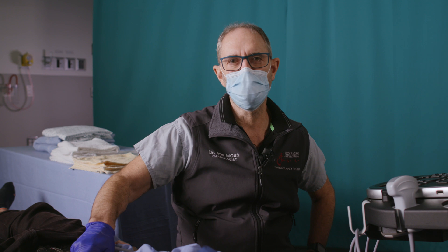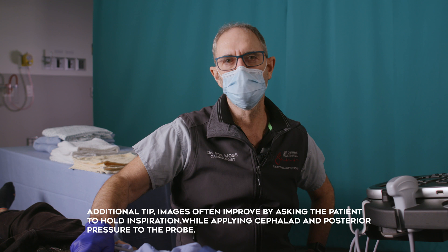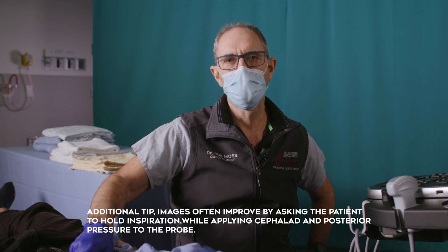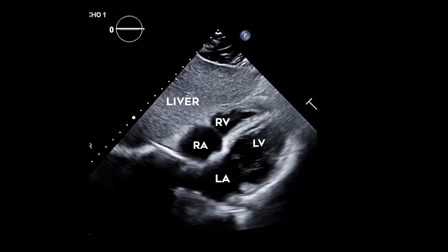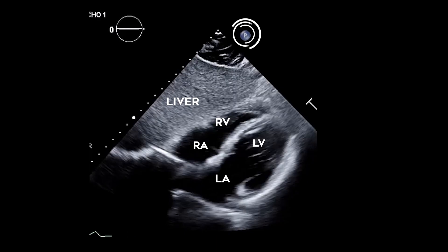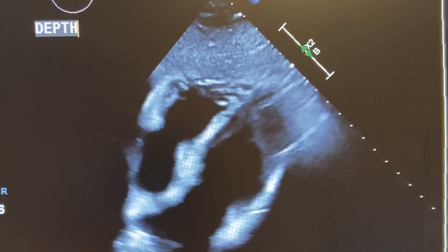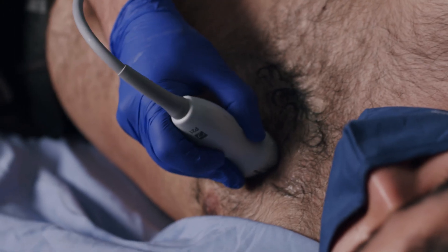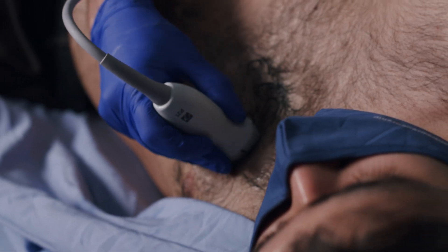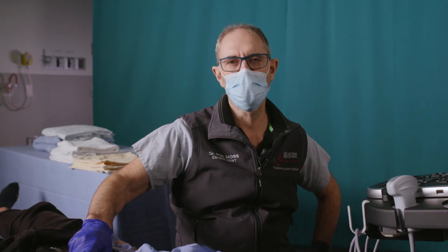A good amount of gel is helpful to maintain probe contact. With the patient correctly positioned, push down and under the xiphoid process. The probe marker is at the three o'clock position, with the probe pointed towards the left shoulder or where the heart is. The image marker is to the right of the screen. Set depth to maximum to start with, and you may need to add more gain. This view is uncomfortable for some patients, so monitor carefully. Tilt and rotate the probe to open out all four chambers of the heart. Now the depth can be adjusted to exclude an unwanted field. Adjust the gains, and when the image is optimized, acquire the image.